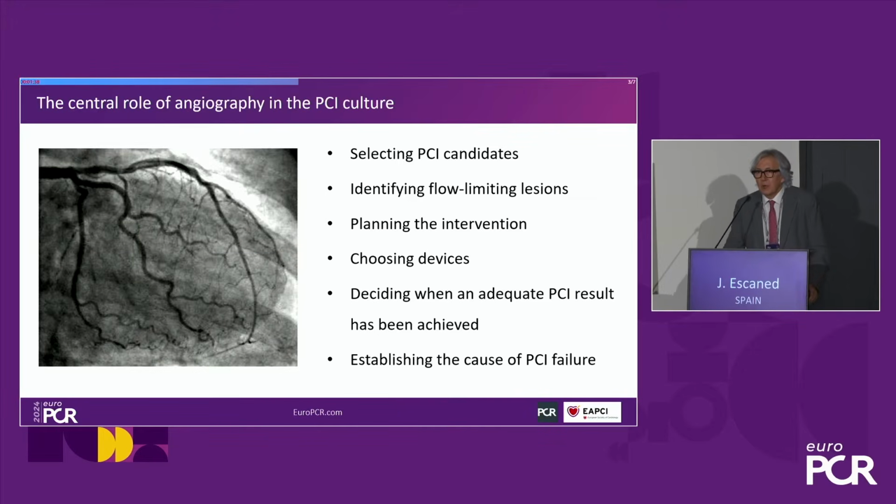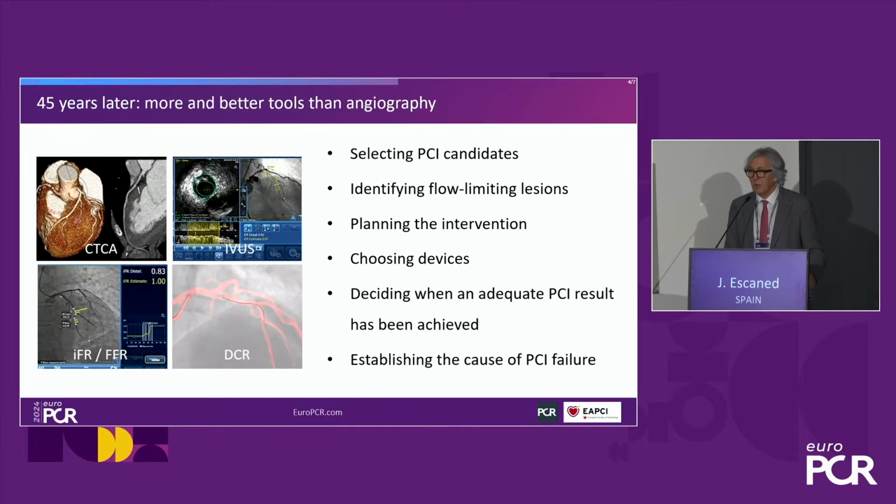Now, we are talking about ultra-low contrast PCI, but let me just make a brief reflection about the fact that angiography was used for many years, but particularly since the time that Andreas Gruentzig developed it, to address all these different important questions that you have in coronary revascularization. I'm not going to go through the whole list. I'm just going to say that it's very interesting that still in many cath labs in the world, this is the only technique that is being used for answering these questions, while in practice we have many other tools that can give not only an answer to that question like angiography, but a much better answer to these very important questions.